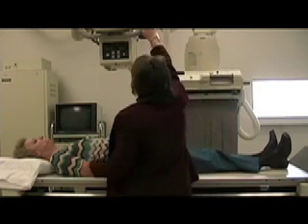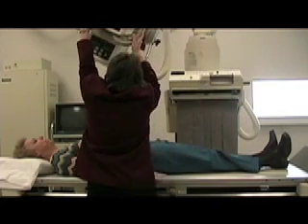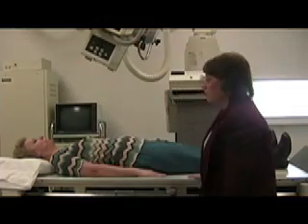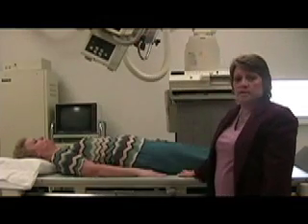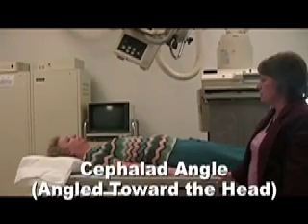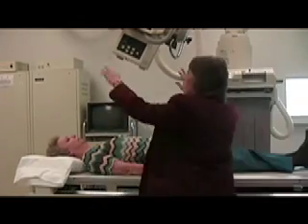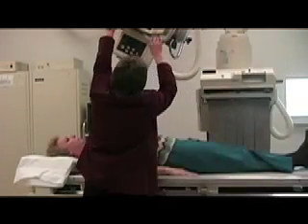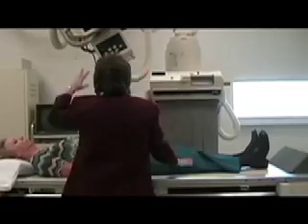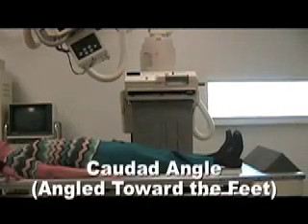Then we're going to angle our tube toward the head. If we angle toward the head, this is a cephalad angle. Then we'll angle our tube to the feet, which is a caudad angle.